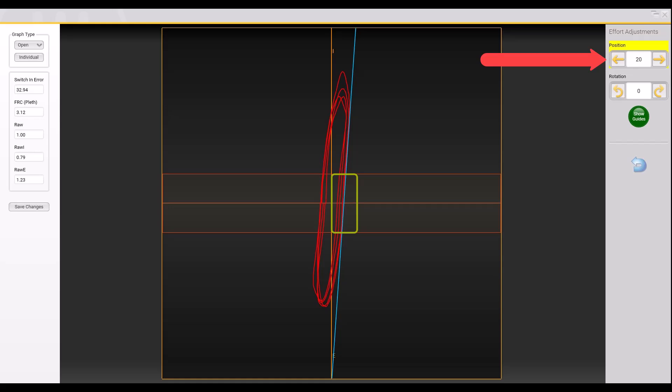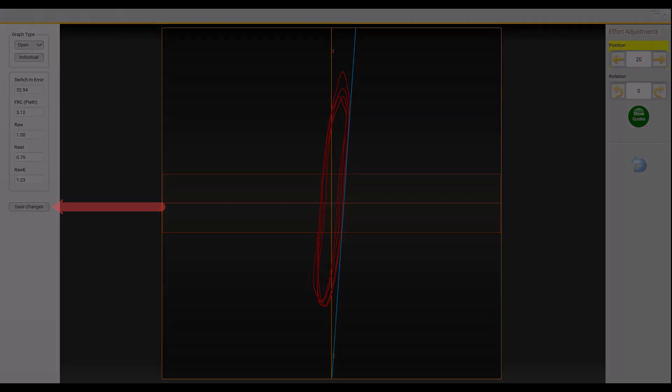Using the right side of the graph and only the data between the red flow rate lines, ensure that the line of best fit is at the same angle as the red tracing. Moving the line left or right does not change any of the values — only when adjusting the angle of the line does the airway resistance value change. After a change has been made and you wish to save your changes, select the Save Changes button.